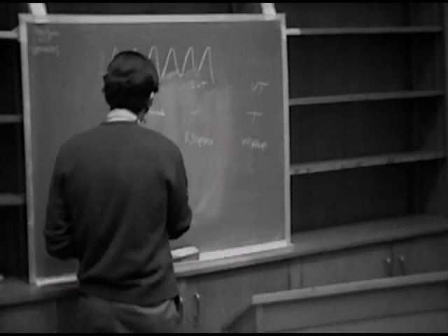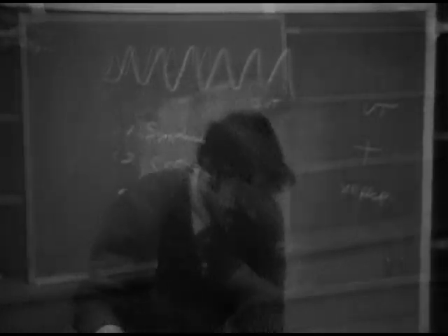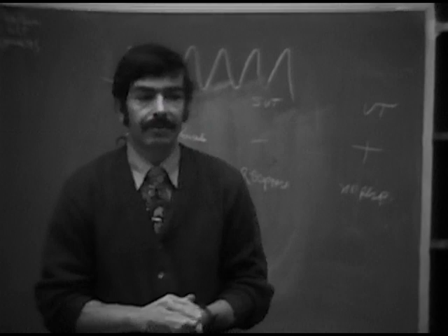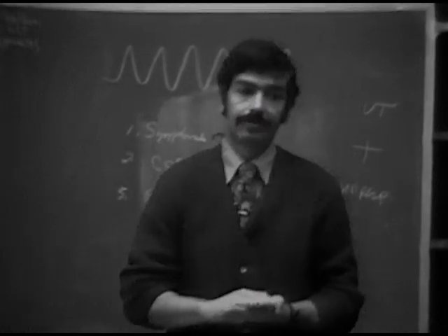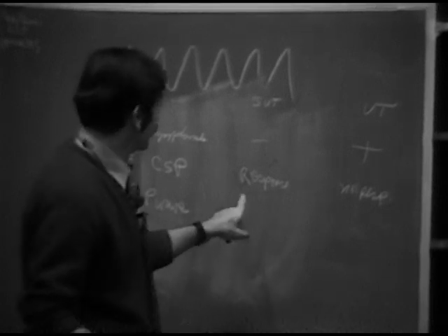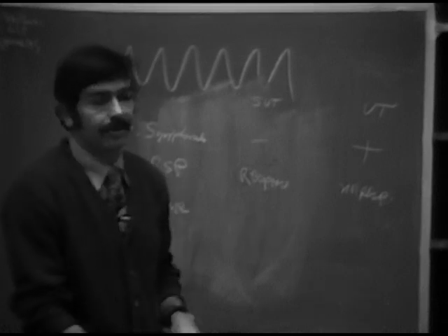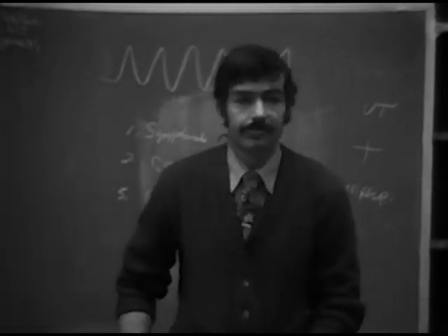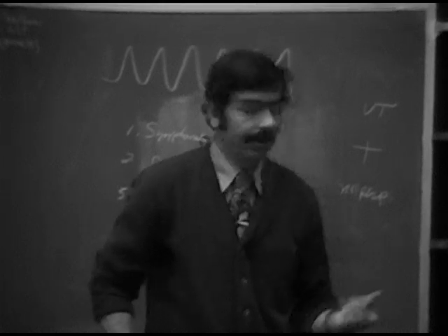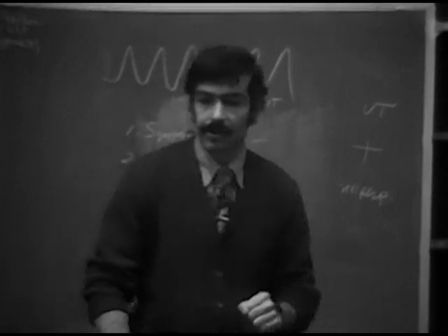So let's say that we find P waves in the electrocardiogram and can ascertain their relationship to the QRS complex. Okay, now, if the ventricular rate is greater than the atrial rate, what are we dealing with, most likely? It's AV dissociation, and in this case, it would be most likely a ventricular tachycardia.